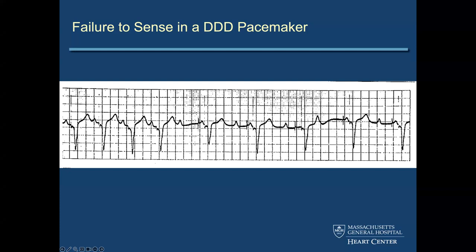And then why did we say that the fourth ECG, which is showing a P wave, did not sense, despite that we can see a P wave? And if we cannot see a QRS, does it mean absence of sensing and pacing? Because I think that if we don't see a QRS with a spike, that means there's sensing, and if there's a spike, there's pacing. So once we don't see it at all, does it mean that both sensing and pacing of the ventricle are absent? And the final thing is, again, the P wave. Why did we say that there's no sensing despite that it's there, even though it's closer to the T wave than the other ones? Thank you.